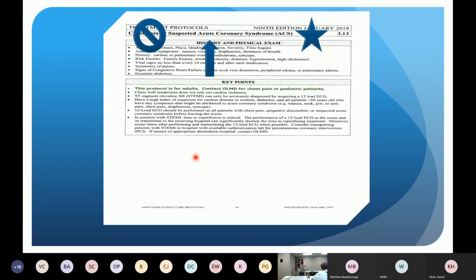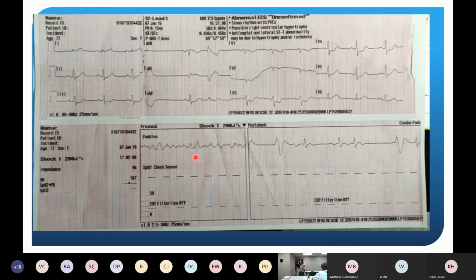He was working in the Birmingham area, got a 12 lead. You look at V2, V3, we got ST depression, T-wave inversion. That is a posterior STEMI, different than that one I showed a few minutes ago. Biggest cause of death with these things is VFib arrest.